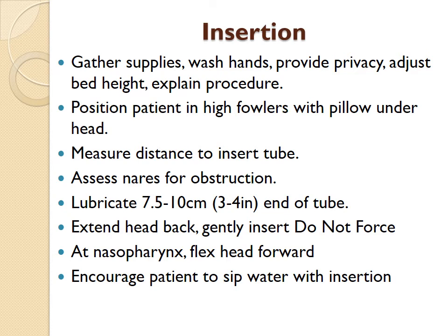Now, prior to doing this, prior to even lubricating it, because as I said, the Levine is pliable, whereas the Salem sump is not. It's more of a tougher plastic or silicone. I usually roll it in my hand a little bit, and we'll discuss it in lab, but I usually roll it around a little bit to soften it up. Some books do suggest that you can soak the first 6 inches or so in warm water. A lot of times you're not going to have time to do that, but you do have different options. I usually just curve it a little before I lubricate it.